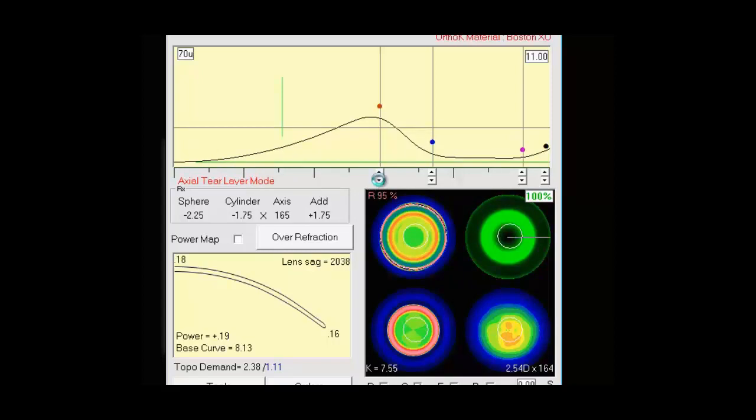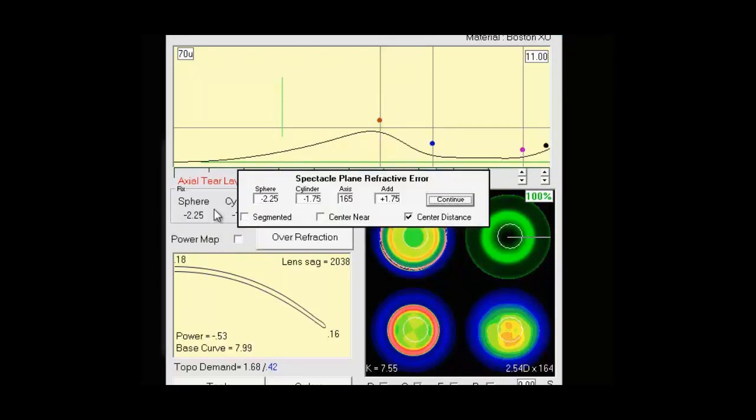We have arrows we can click to control our control points. Or we can drag and drop them. Moving down we have the Spectacle Refraction box. To edit or enter Spectacle Refraction left click on it and this box comes up. We can enter or change it.